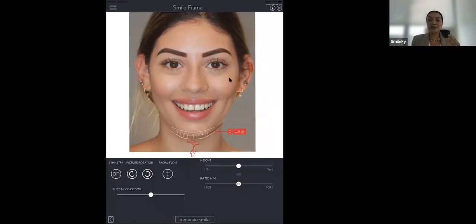You take the picture with the patient in natural head position, and you can observe that the eyes are at the same level as the camera lens. So the patient is seated here. You can have a little spot next to your chair or next to your panoramic where the patient sits erect, and then you take the picture. If you see a big smile, if you see part of the buccal corridor, you succeed. It's very important that the patient has a little space between the arches.